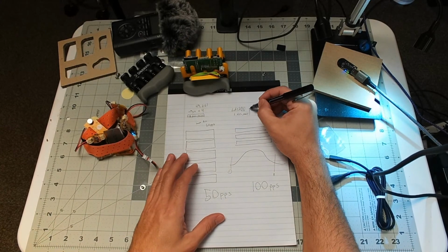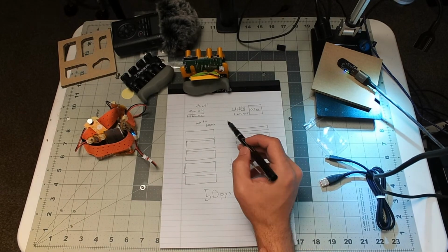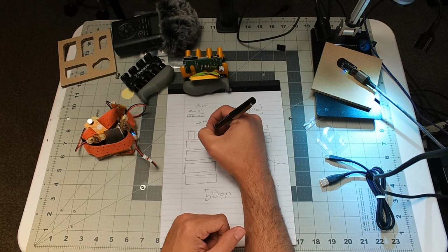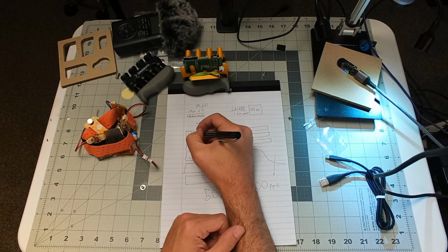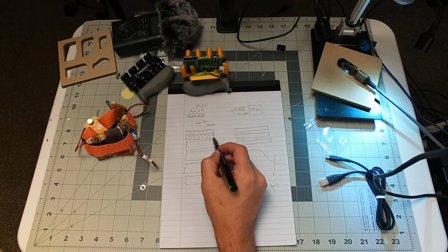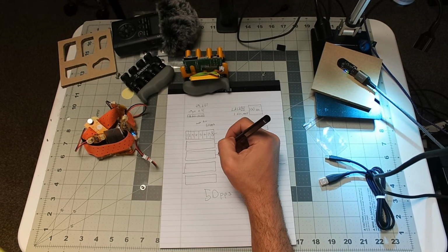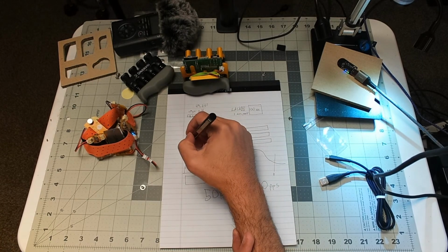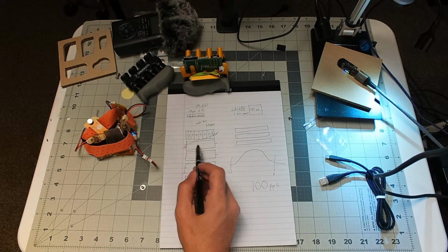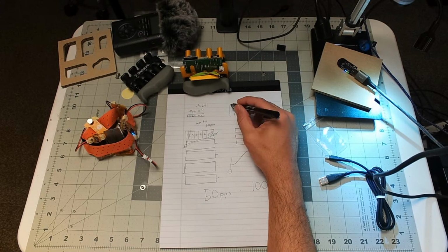So for every 100, we're going to have to throw out the LASK values, which is good, because I thought we were going to have an interesting situation. Inside of each packet from uMyo, we have 8 data points: 1, 2, 3, 4, 5, 6, 7, 8. And they pretty much butt up to one another, is my guess, right? So as each packet of 8 comes in, we're going to try to match it with a LASK.